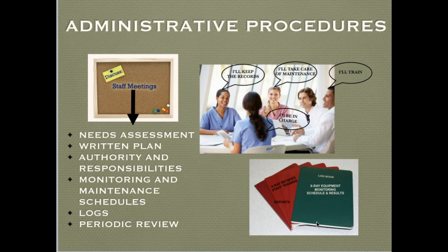And most states do have a radiological division. Sometimes it's part of public health. Your equipment should be registered with the state or your county. You need to check in your area and see what the regulations are, but they also want to see information in writing so that there's some proof that you're actually working to create minimum exposure.